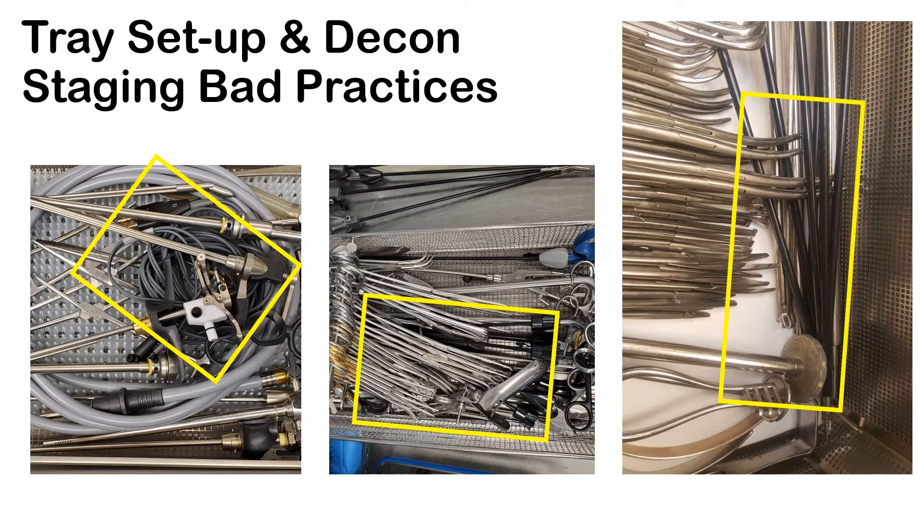Just because an insulated item passes insulation testing doesn't mean it's actually good to go. You still need to look at scratches, gouges, and lacerations that maybe pass the insulation test because the damage didn't go all the way through to expose the metal — but it still allows bioburden to settle in those areas.